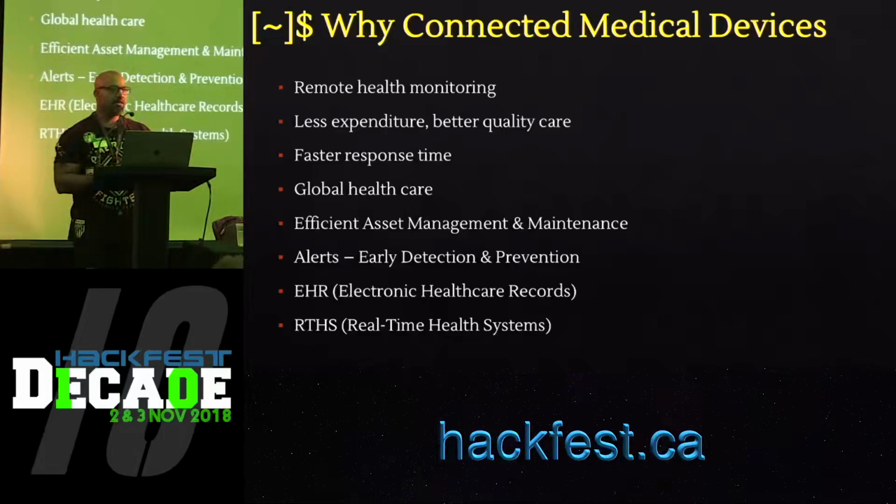As a closing remark, these are pretty generic. I would say that because there's a lot of race in getting these devices out, the security is bolted on rather than built into the devices. So the devices come out and then someone posts a vulnerability disclosure for a certain medical device and then they try to implement security on top of it, which has never actually worked. It's hard to trust devices, so it's hard to differentiate between legitimate medical devices and malicious or compromised medical devices. So that's another problem because network segmentation is going to be a problem.